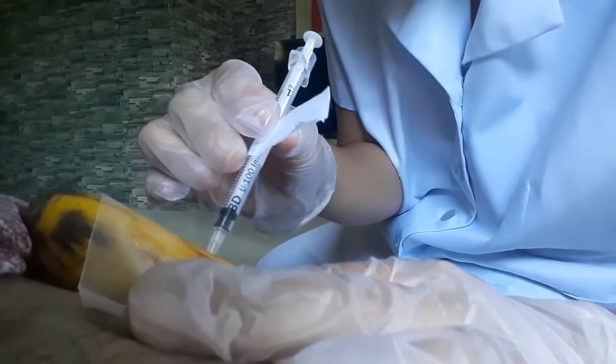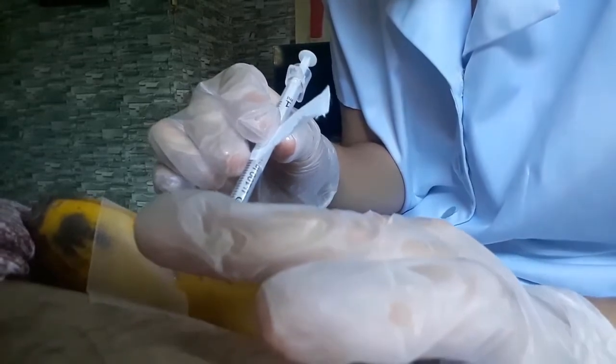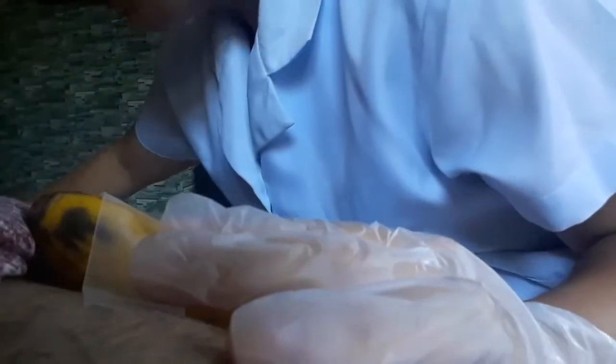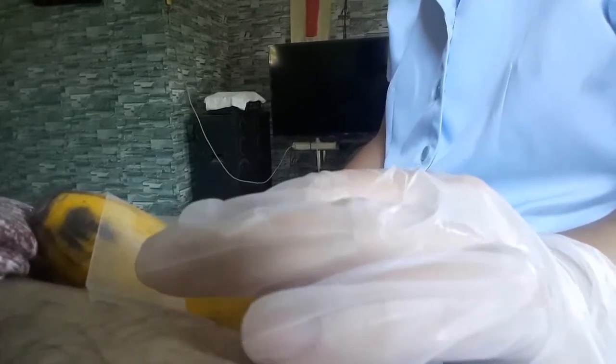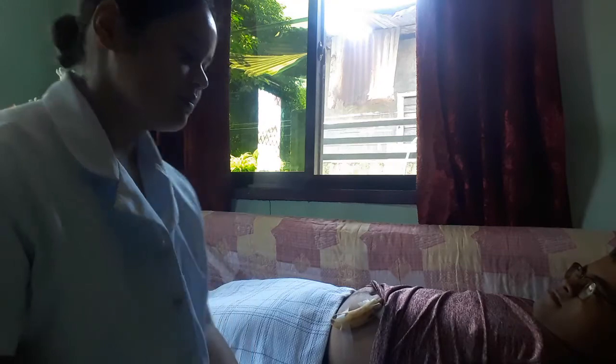After injecting, withdraw the needle and place a swab or cotton ball, and make sure that it is not massaged because it may damage the tissue. Now, place the patient in a comfortable position and document all the procedure.